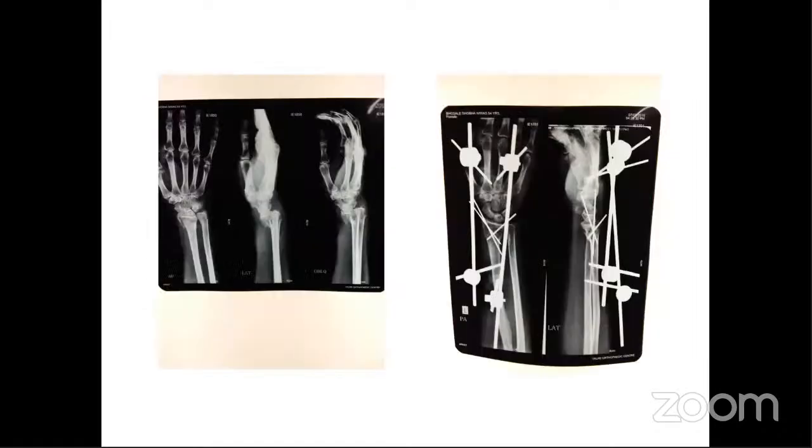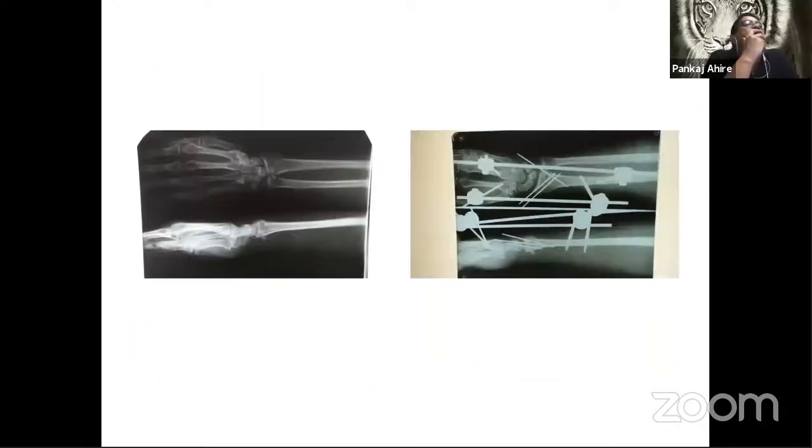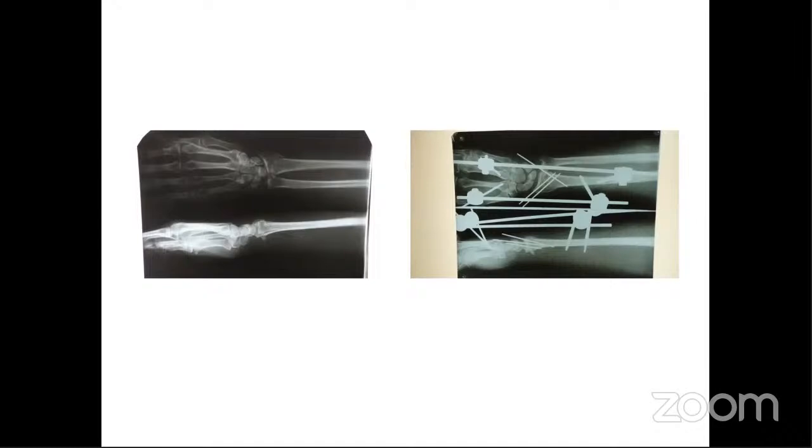This is a far distal radius, which will not have purchase with only K wire. So we use fixator as a distraction module to maintain the length and fix it with K wires. This is another case of far distal end radius, where we put in a fixator and fix it with K wires.